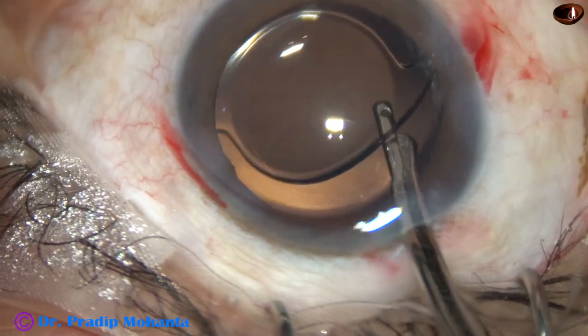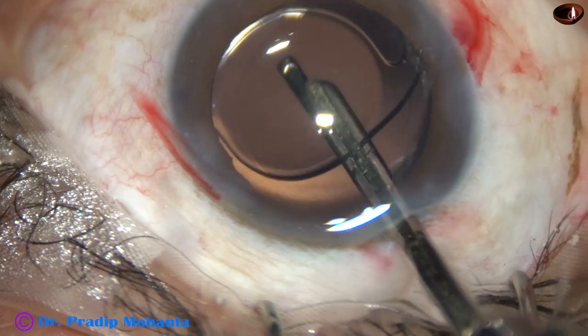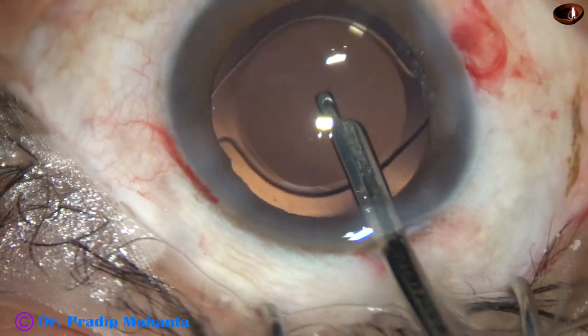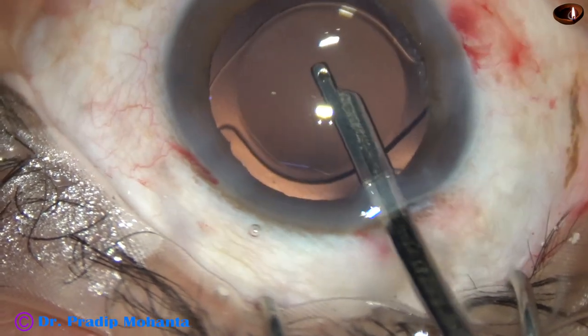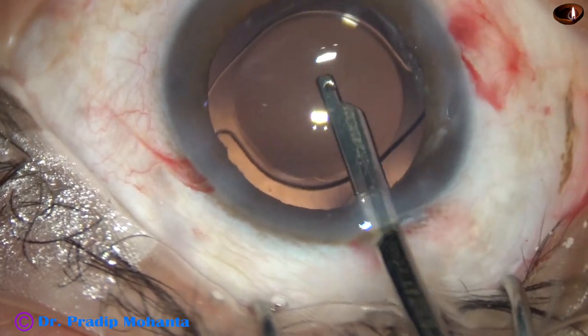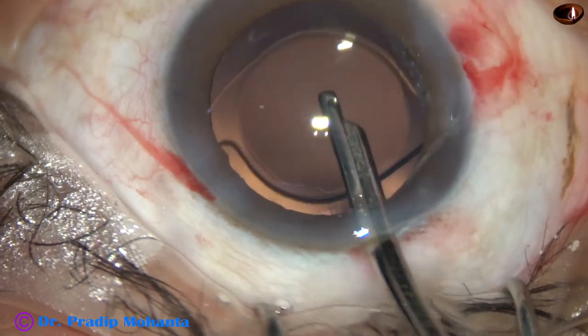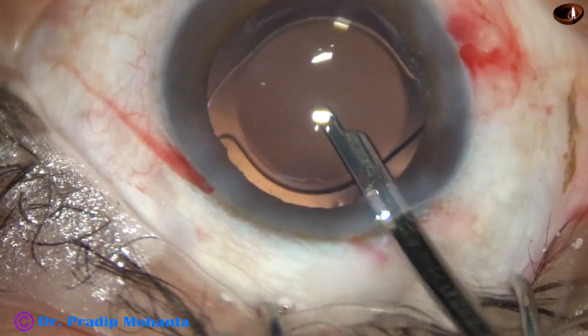In this case, PHACO parameters: power was 50% ultrasonic energy. Flow rate was 45 ml per minute. Vacuum was 450 millimeter of mercury.